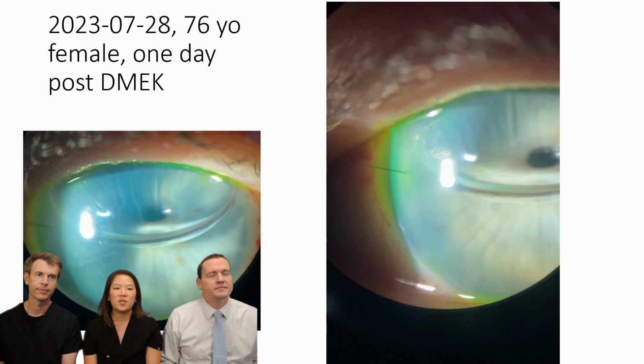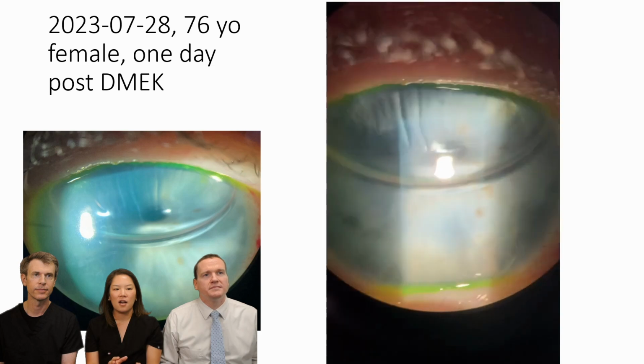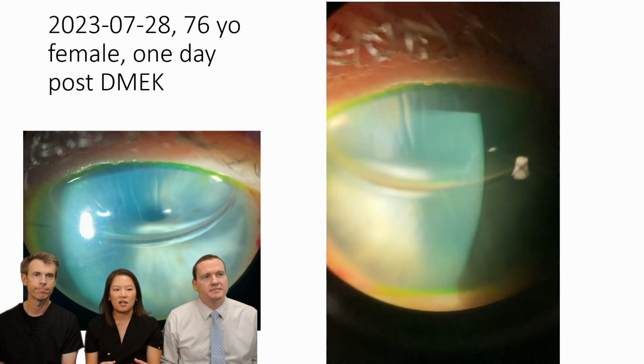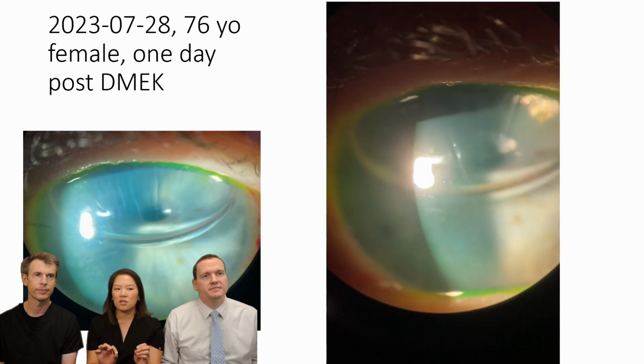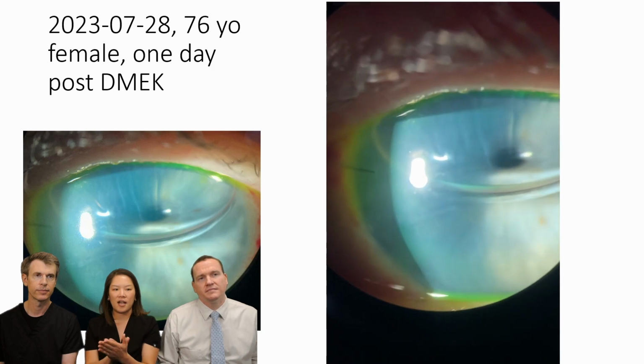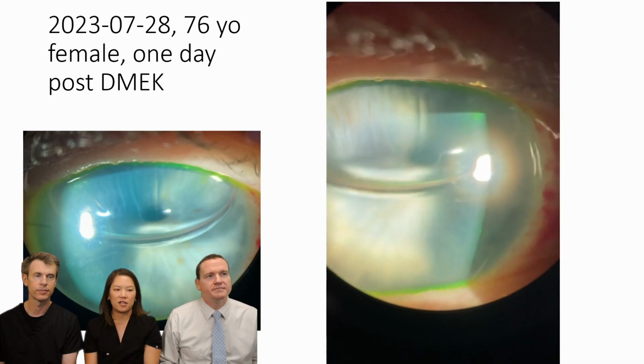on itself. So this is a post-op, and what you'll see is there's some folds there, a bigger bubble, and you'll actually see a little bit. Sometimes there's still a little bit of fluid in the interface between the cornea and the graft, but overall you're seeing that it's pretty compact and the clarity has already improved.